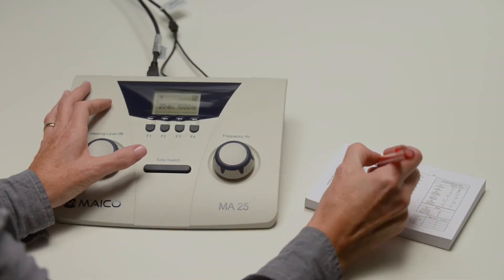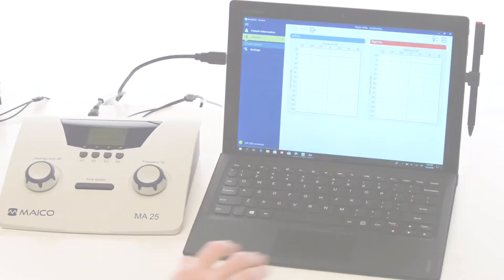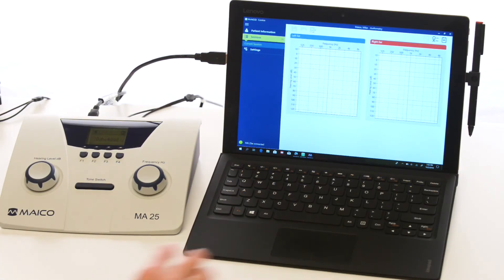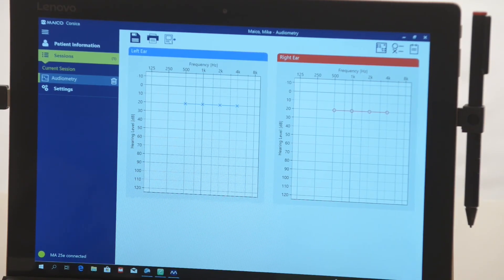Results can be captured on the included audiogram pad. There is also an e-version model to store results in the device and allow PC transfer. The device must be connected to the PC while the testing is being performed. Results are not stored in the device after it is turned off.